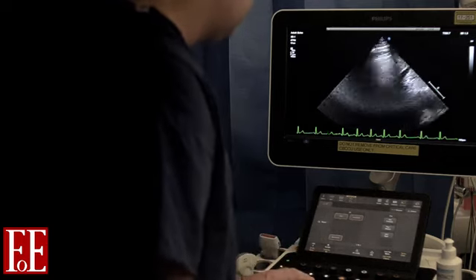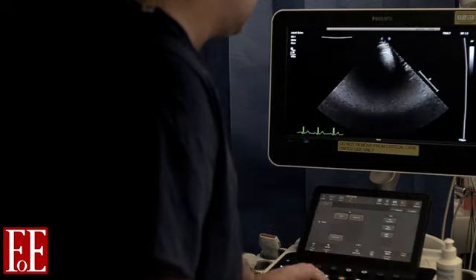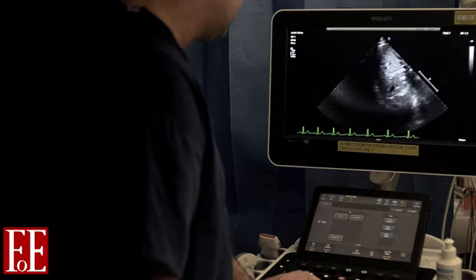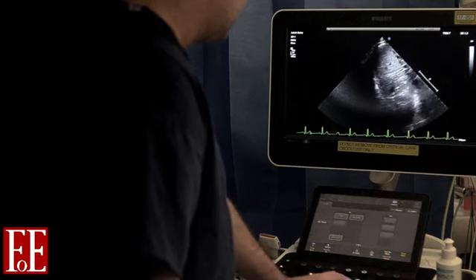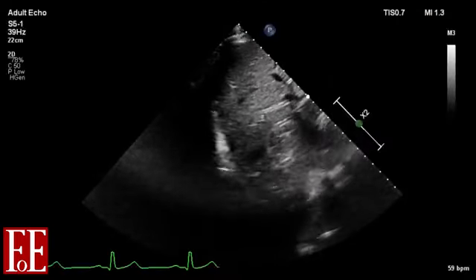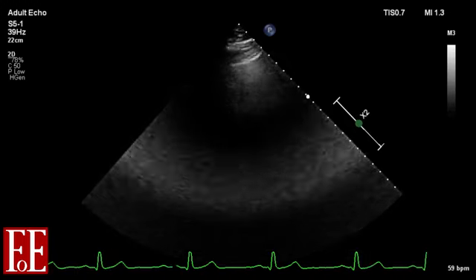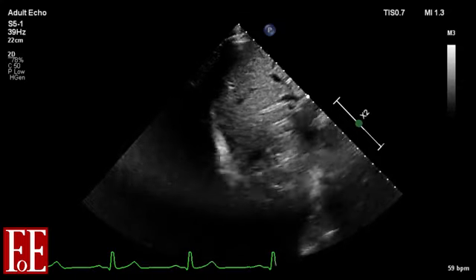take the probe off the front of the chest, and we're going to place the probe in the mid-axillary line on the right-hand side, and we're going to orientate the probe such that the abdominal contents appear on the right-hand side of the image, and the thoracic contents appear on the left-hand side of the image. So with our probe set up for cardiac imaging, that means we're going to have the orientation marker pointing towards Oscar's pelvis. I'm going to place the probe in the mid-axillary line over the large abdominal organ that's easy to spot. So on the right, that's going to be the liver.